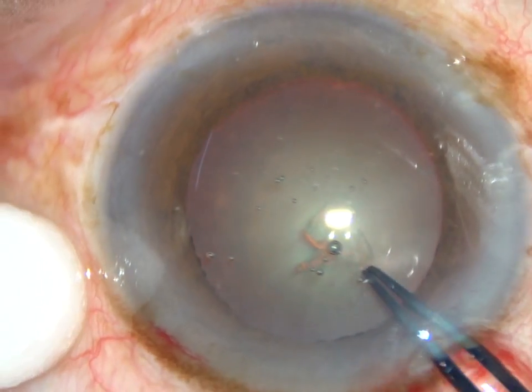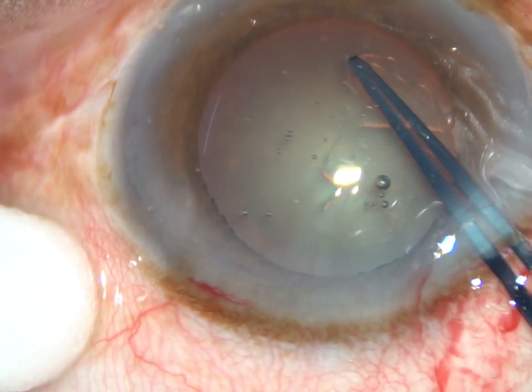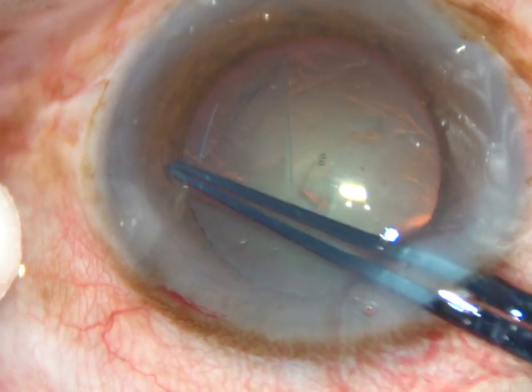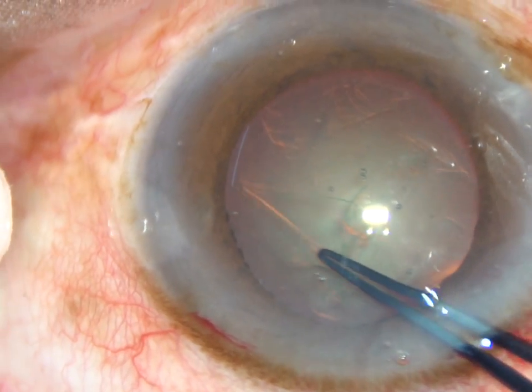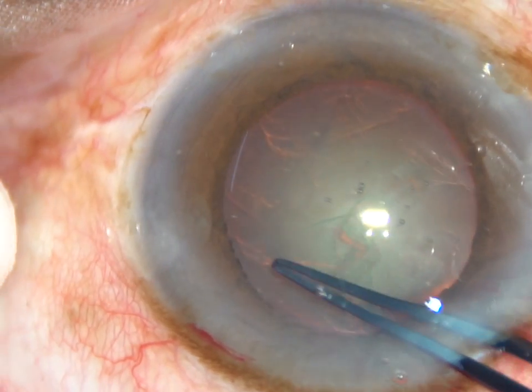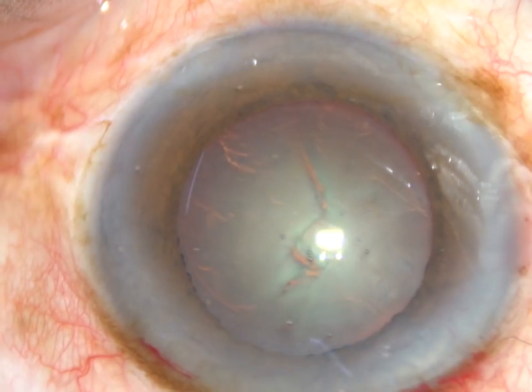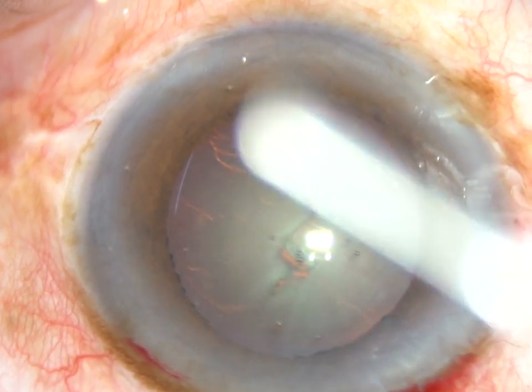After the initial steps, capsulorhexis is being done with the help of Utrata forceps at this moment. Continuous curvilinear capsulorhexis is completed and now hydrodissection is to be done.